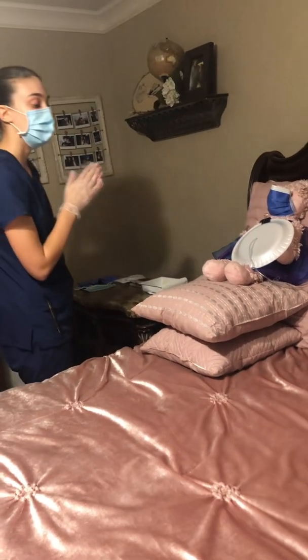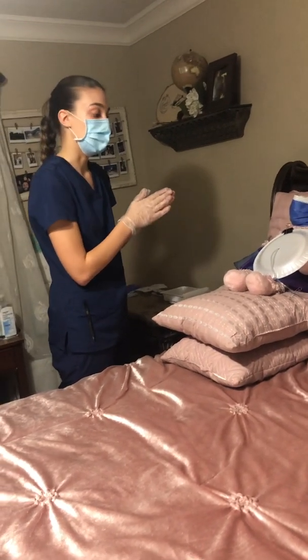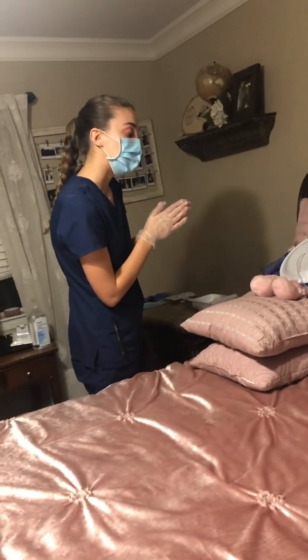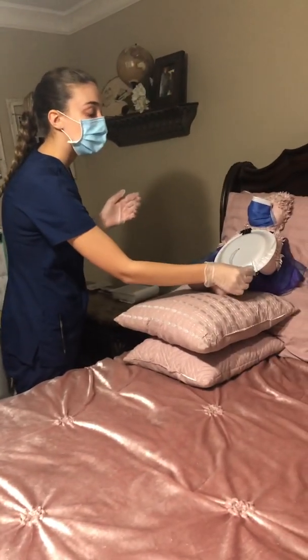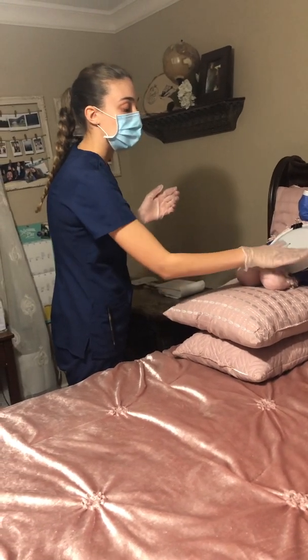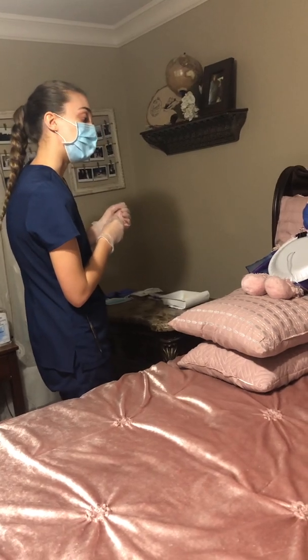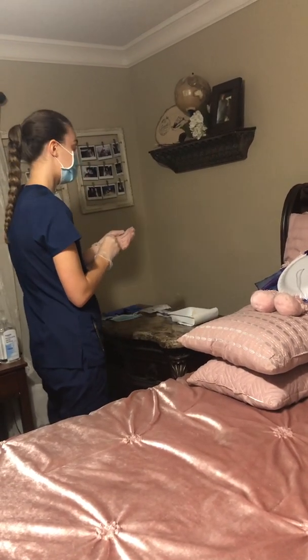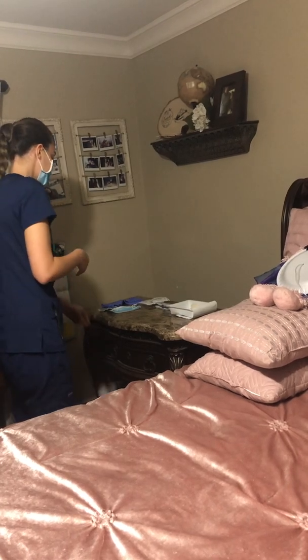And now I'm going to assess the site, check for any signs of inflammation, swelling, redness, fluid. And the site looks clean, dry, and intact. I'm going to assess the tubing as well, check for any cracks or leakage, and it looks good. Making sure that that stays within the 4 inches from the lock to the insertion site. Alrighty, now I'm going to go ahead and discard my gloves. Wash my hands.